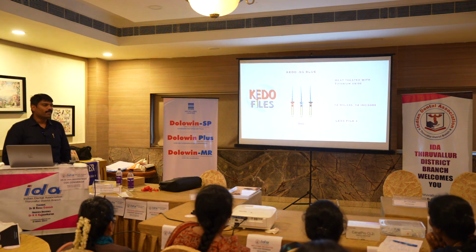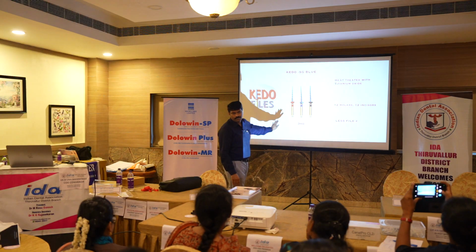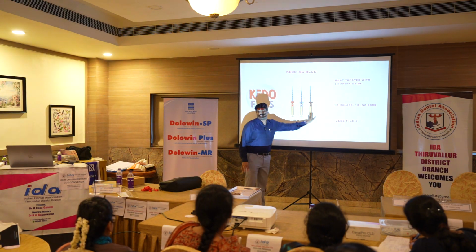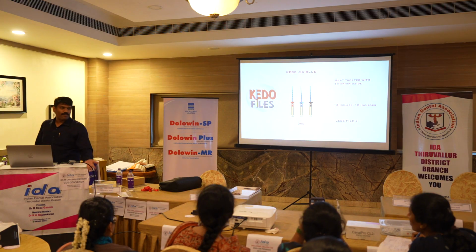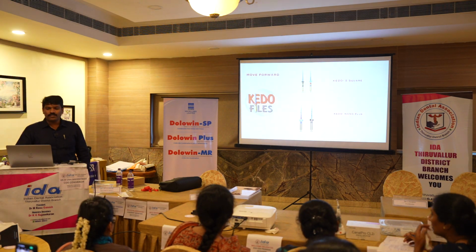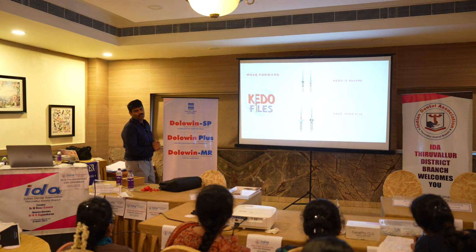Now to start, if you are using a pediatric rotary file for the first time, I would advise you to start with SG Blue. Mesiobuccal, mesiolingual, distal and anterior. First time, SG Blue. You will have less fracture, you might not even have fracture at all. Once you are okay with this, you can either change to S Square or Nano, the single file system. That is up to you to choose.